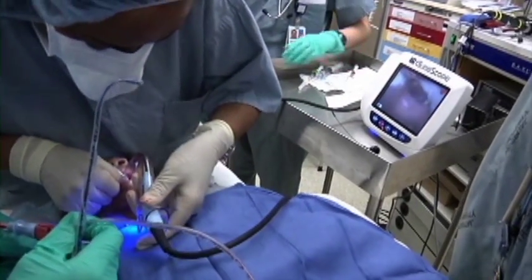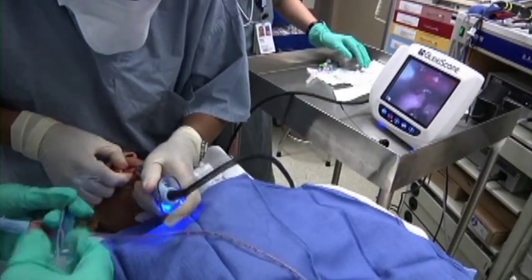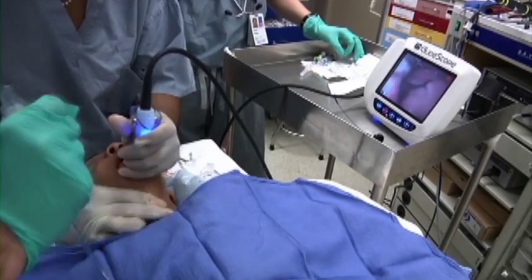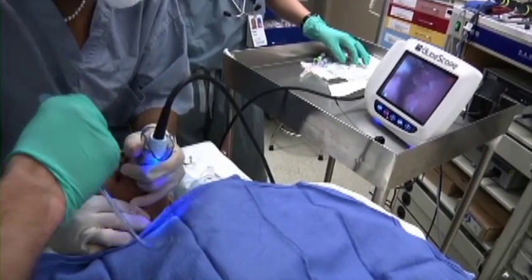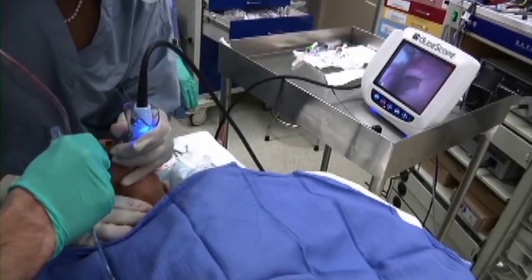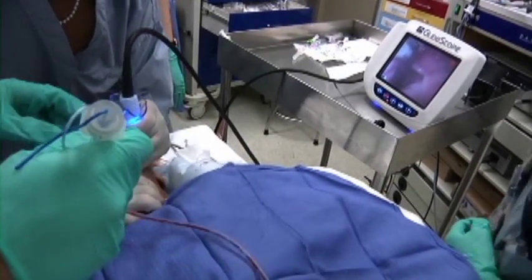We scissor open the mouth and do a midline insertion with the laryngoscope — no need to sweep the tongue. A shoulder roll was utilized to improve the view. We then opted to use a GlideScope with a number one stat because of the patient's small mouth opening and her severe micrognathia.